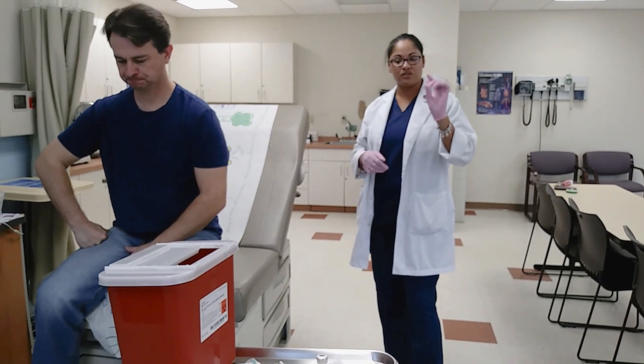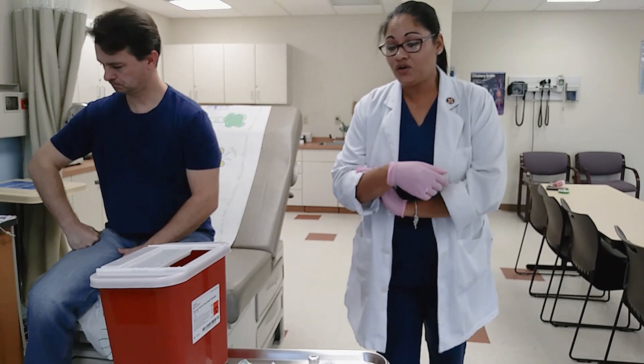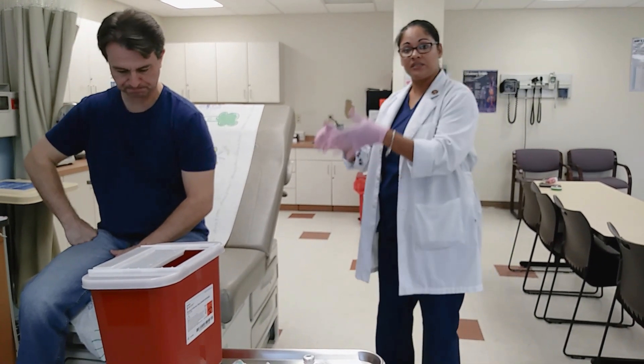Let me give him an intramuscular injection, subcutaneous injection, as well as an intradermal injection. We have to make sure we know who our patient is, identify ourselves, follow our sterile techniques, as well as the seven rights of administration.